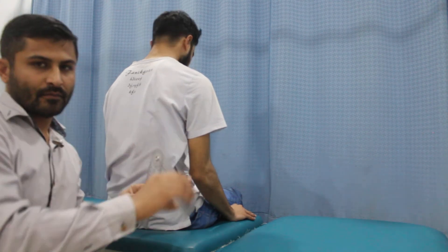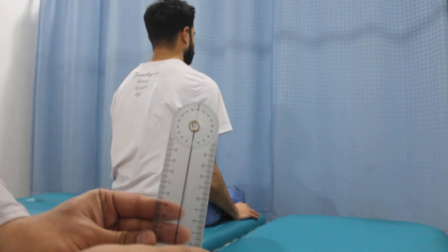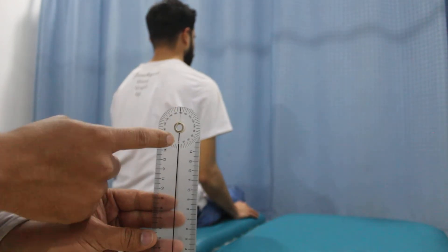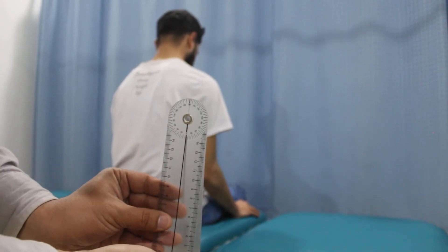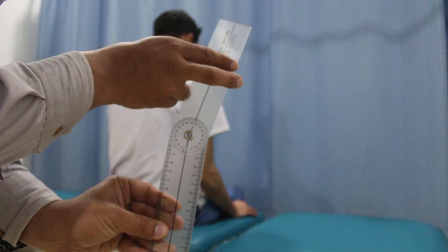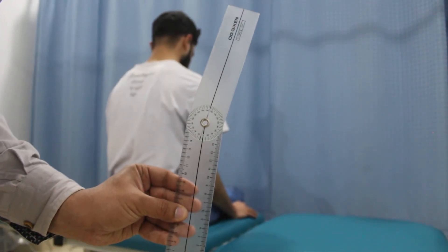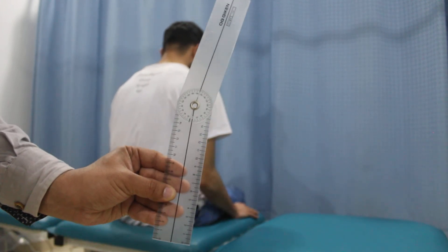Now if you can see, let me show you — the starting point was like this, the goniometer was at this point, and when he performed the active range of motion it moved all the way from this point to this. So that is the range of motion for abduction. Thank you very much.